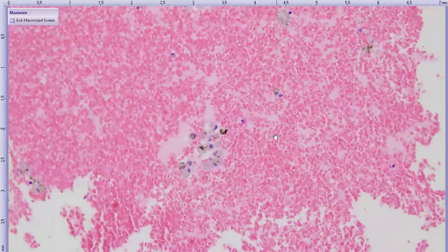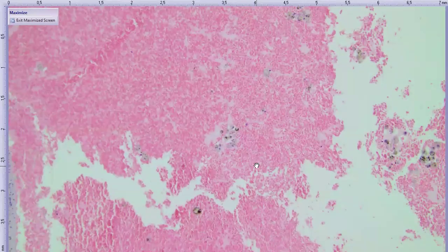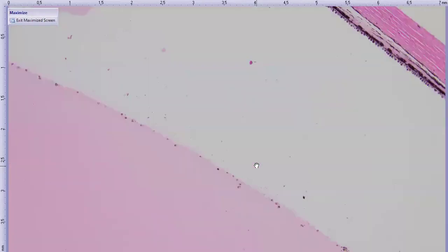And then just moving into our subretinal hemorrhage. Indeed, there's some hemosiderin within macrophages, indicating these macrophages have been in here to clean up this blood. Again, just supporting that this is a more chronic hemorrhagic process. And then just a sea of proteinaceous material in the subretinal space.